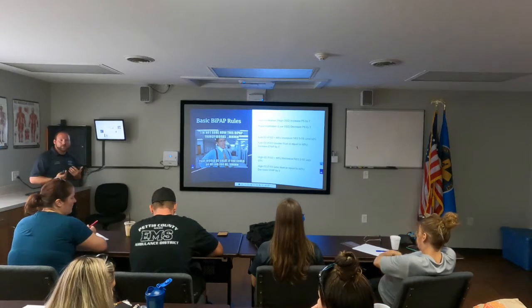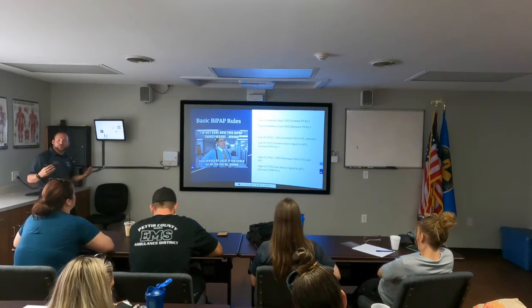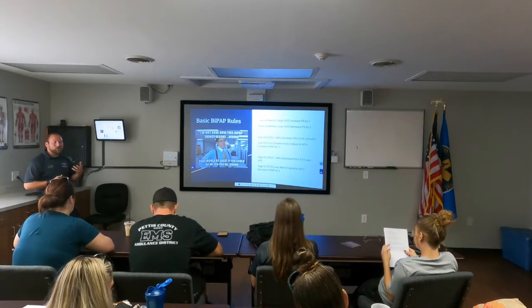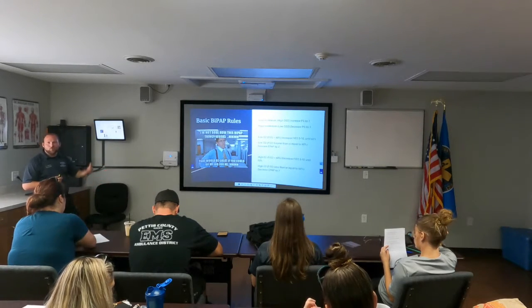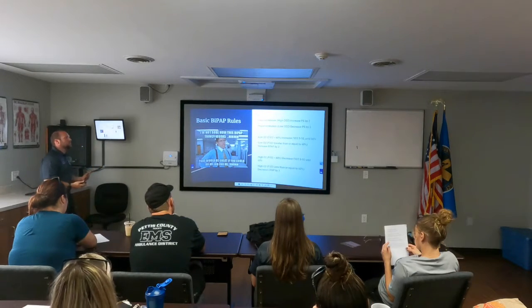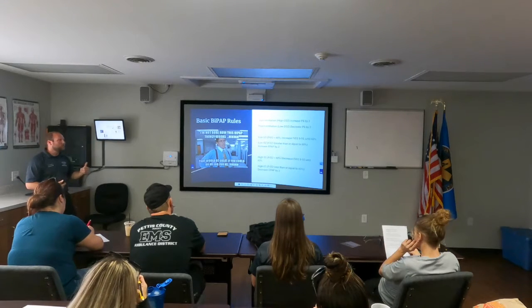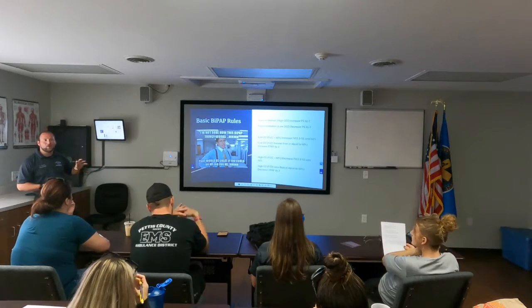So the paper that I hand out to everyone is, like I said, basic BiPAP rules. This is how your initial start should be when you pick up a patient who's on BiPAP. We are looking at, okay, Bothwell's got them on BiPAP. What are their initial settings? What can I do to change to make it more comfortable or appropriate for our patient? So the way we're going to talk about this is, are they hypoventilating or hyperventilating? We're going to talk about what's our O2 level, and then we're going to either increase our FiO2 or our PEEP.